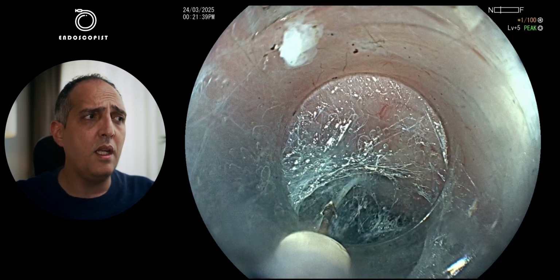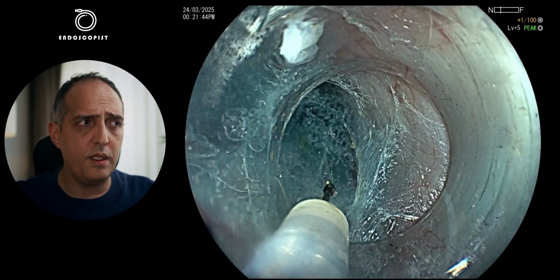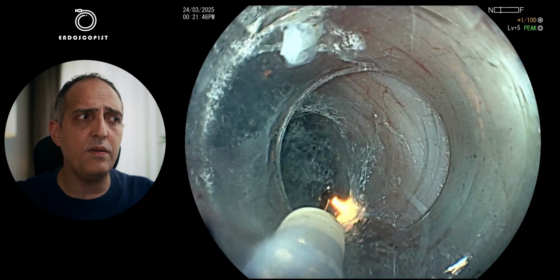I keep my tunnel small. I just do the tunneling that I need to pass with the scope. I'm not a big fan of huge tunnels.